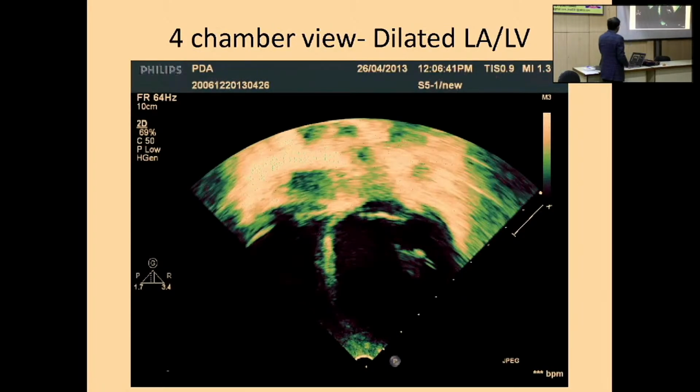Okay. Anyway, so which chamber is dilated here? LV, LA. One more thing now with this side I remember. If the PDA is having right side dilatation and LV is not dilated, that also means Eisenmenger. There are two different components of PH which we have to understand. We all have to understand.